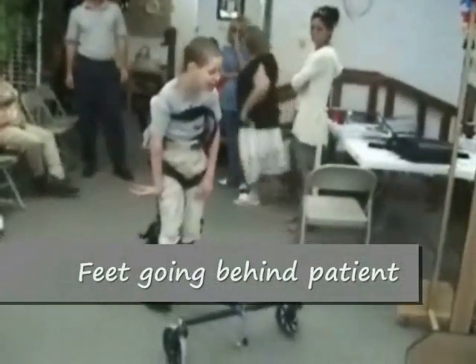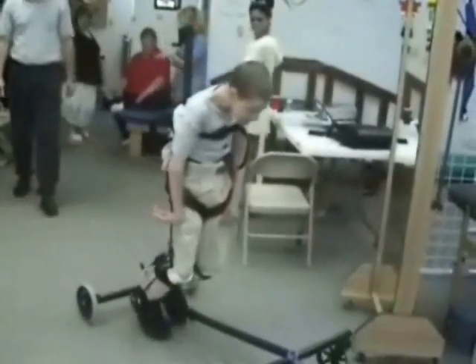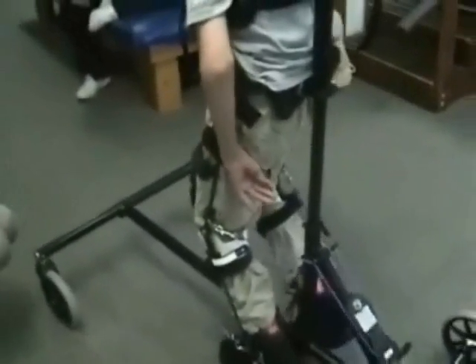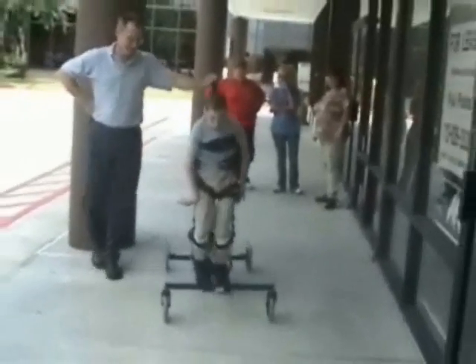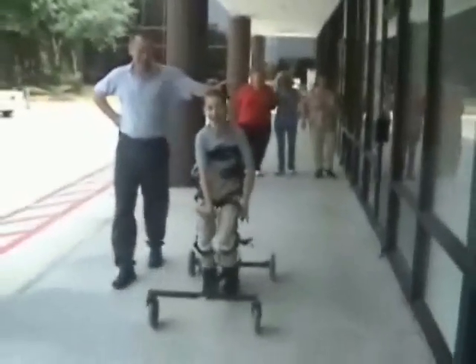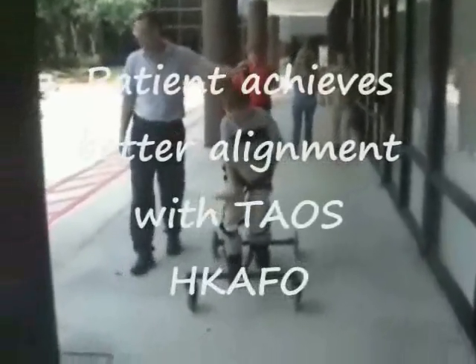This is one of those patients where the feet are going behind them, and we don't want to see that — we want to see those feet underneath the body. At the front and back of the TAOS unit there are cables that attach to the knee and to the ankles, which prevents the feet from going back and encourages a reciprocal gait pattern, which you can see being achieved here.